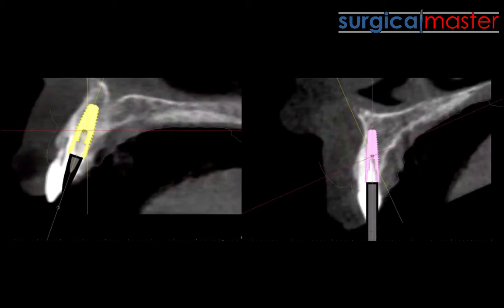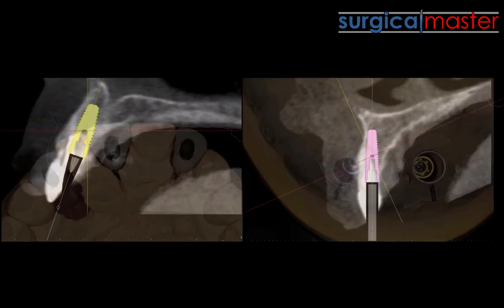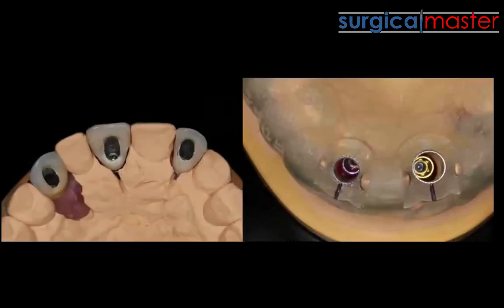Here you see the cross-section for number 8 and 10 — 8 is the yellow implant, 10 is the purple implant. These are the images from the software, and I could tell that I have enough apical bone to stabilize my implant. I ordered another guide for 8 and 10.